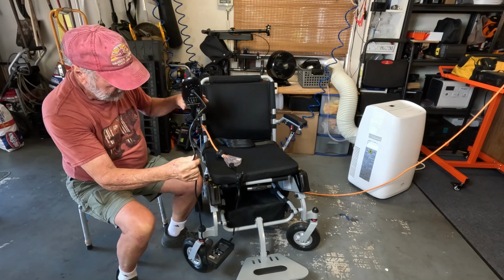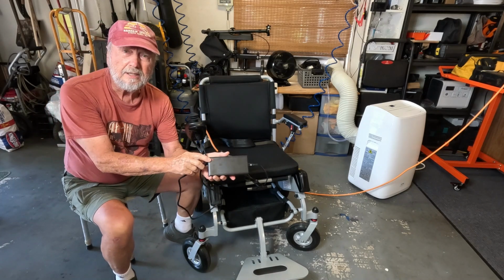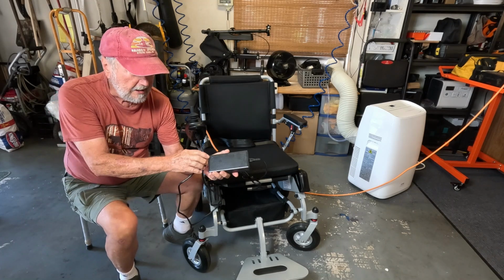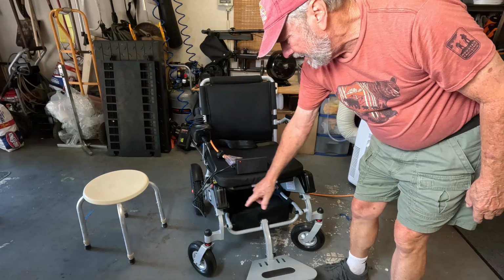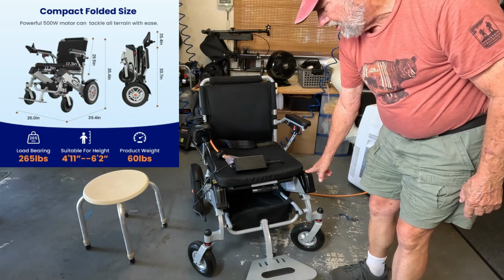And there we go. It's plugged in, and it's red. It's been used for a little bit for testing, and so the battery is charging right now. That's the only battery that's charging right now. And then this one hasn't been used, so it's fully charged.